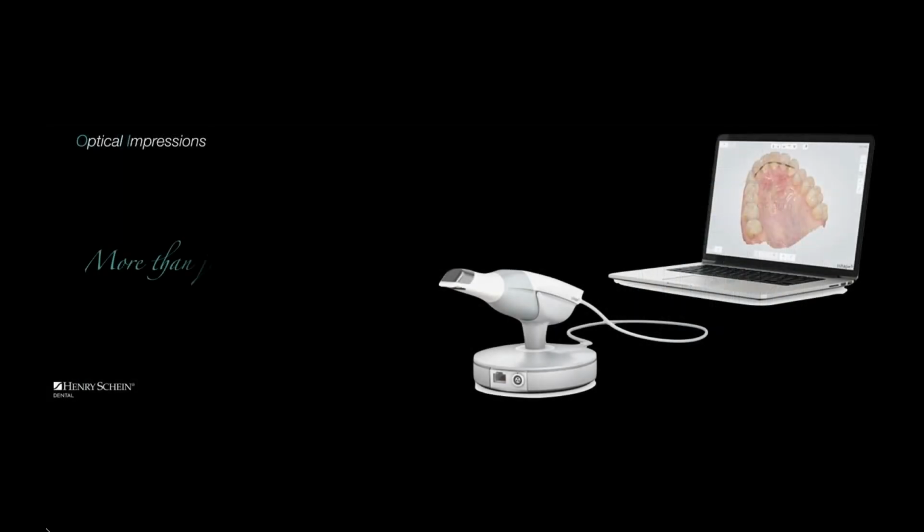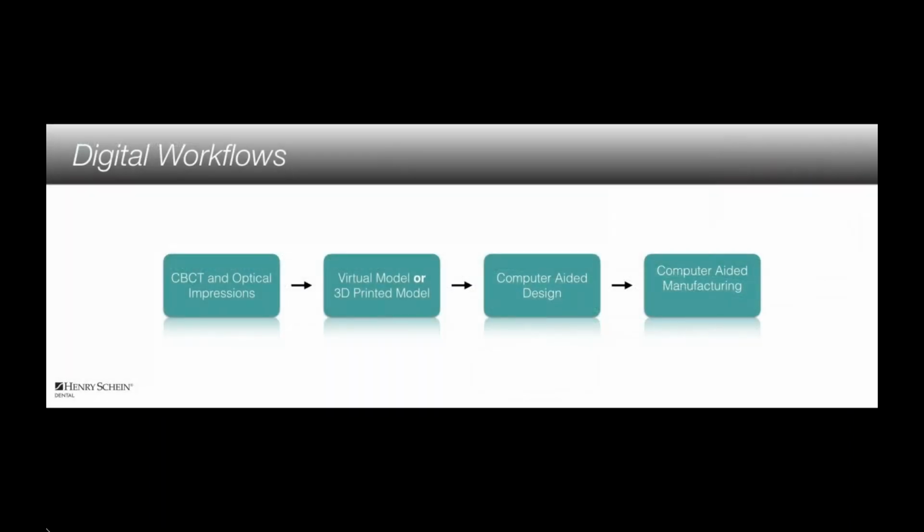And just like cone beam CTs, with optical impressioning or intraoral scanning, it's more than just an impression. It's more than just replacing alginate, because what we can do with that data is really remarkable. What it all comes down to is, how do we get into the digital world, where we can gain efficiencies, save time, money, and effort, and get more predictable outcomes for our patients? The initial starting spot is the CBCT and optical impressioning. It's what I consider today to be data acquisition.